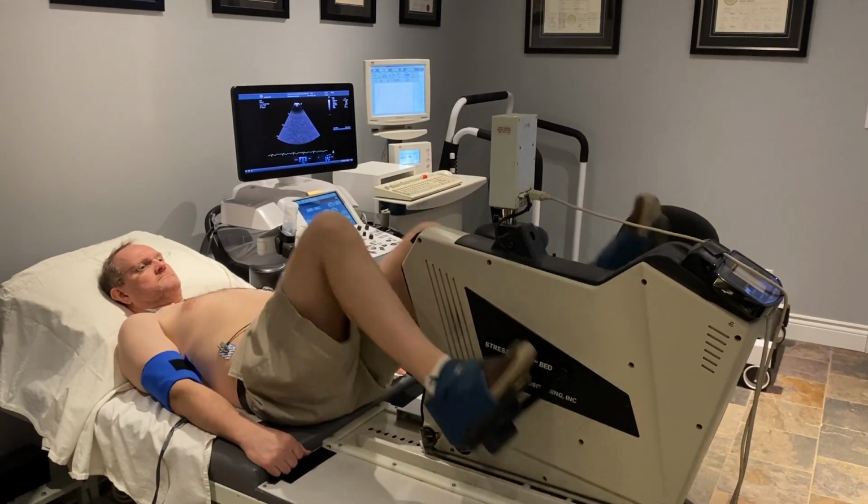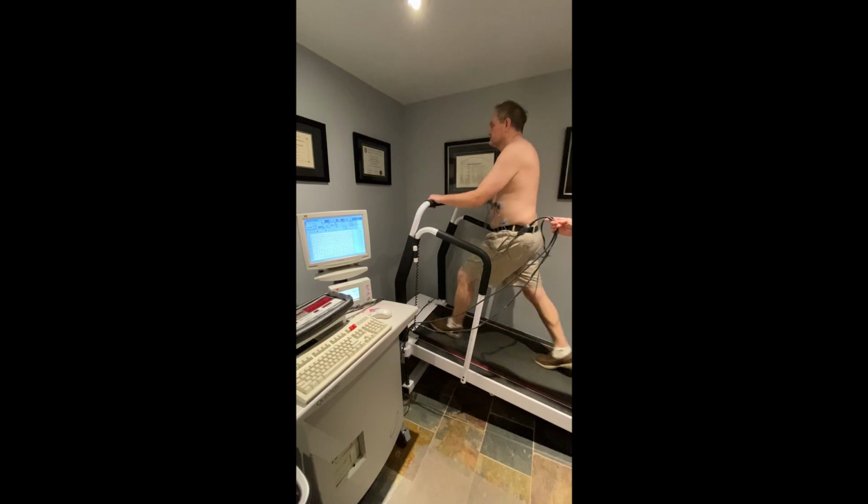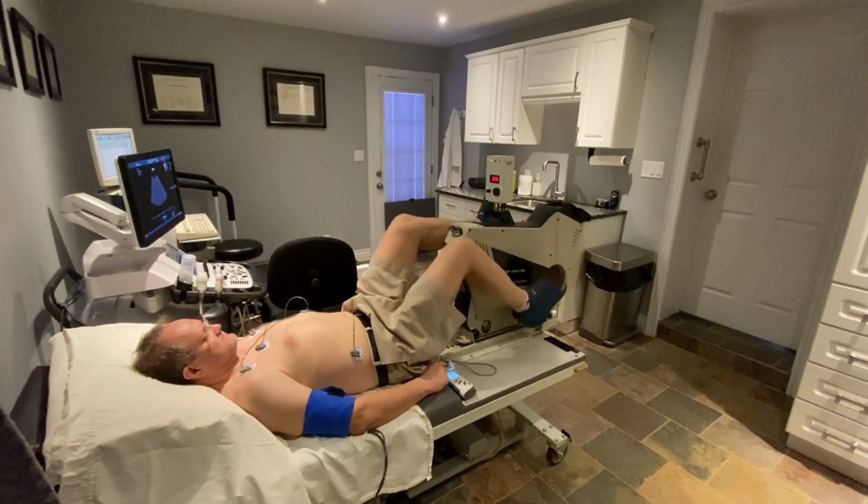If for some reason we do a treadmill stress echocardiogram, then you'll go on the treadmill at obviously increasing speeds and increasing grades. The way we make the bicycle stress test harder is we put more tension on the bike. With the bike, you control the bike and the speed of the bike. With the treadmill, obviously, the treadmill controls you, and that's one of the main reasons a lot of my patients, particularly elderly people, would rather ride the bike.